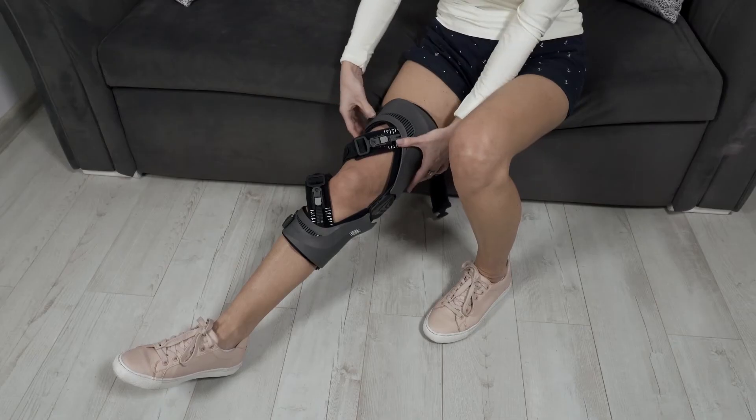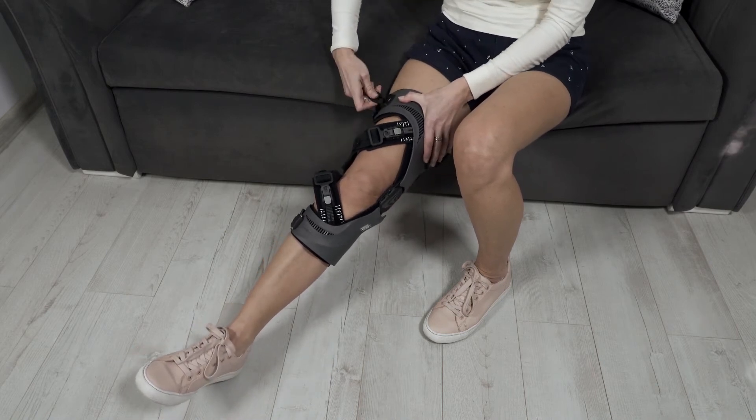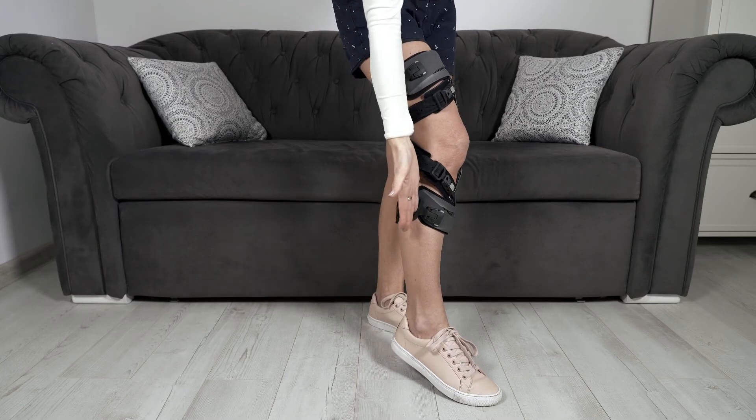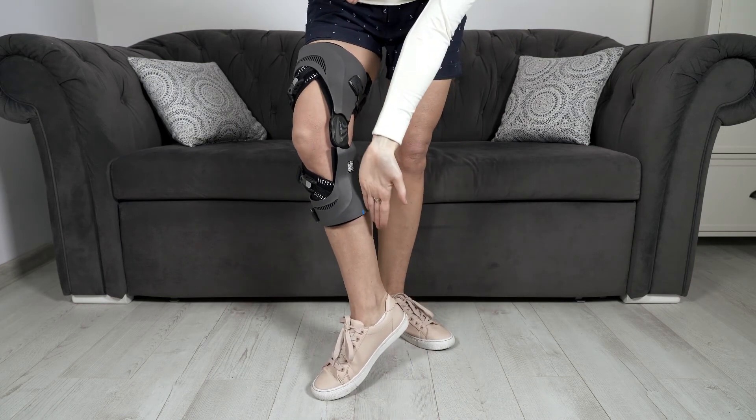If the issue persists, try holding the thigh cuff higher on the leg when applying the number two strap. If the issue still continues, please make sure that the brace is sized correctly.